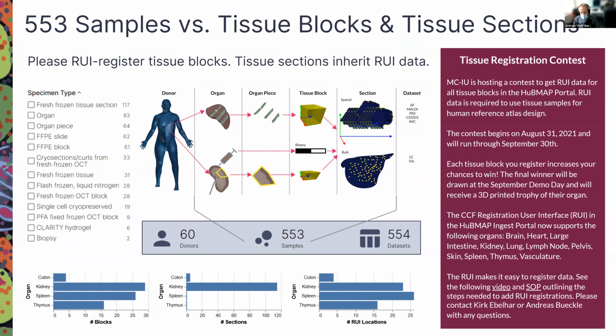Bruce and myself can support any questions attendees might have. I want to start with this slide that some of you might have seen in the steering committee call a few minutes ago, where we talk about the RUI registration contest that is running until September 30th, until the end of the month, where you can add RUI registrations to existing registered tissue in the ingest portal. We will go over how to do that in just a second, after the RUI demo proper. All right, so now I'm going to start with the RUI demo.